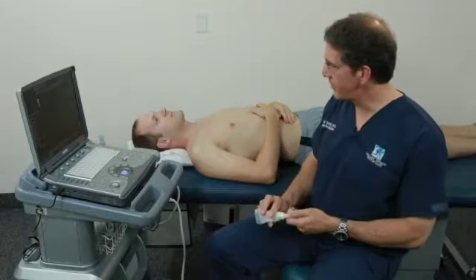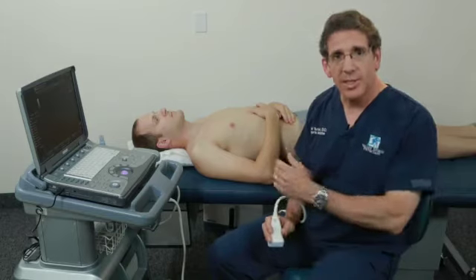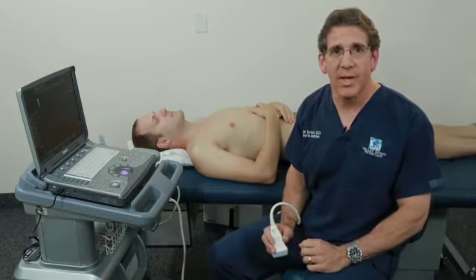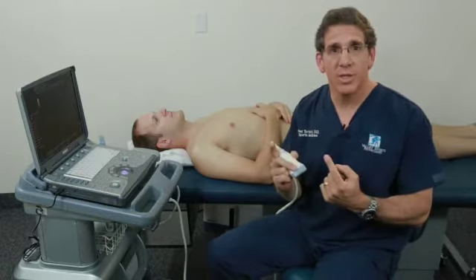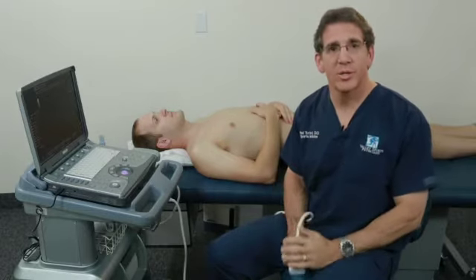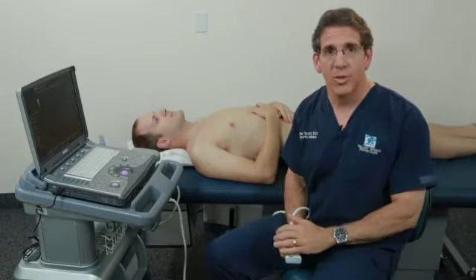So for example, if I'm looking at the lateral elbow, relatively shallow structure on a lean patient, I'm not going to need a lot of penetration or depth to scan that. Also keep in mind that scanning depth and scanning frequency are inversely relational. The higher your scanning frequency, the less depth or penetration you're going to be able to get, and vice versa. The lower your scanning frequency, the more penetration.